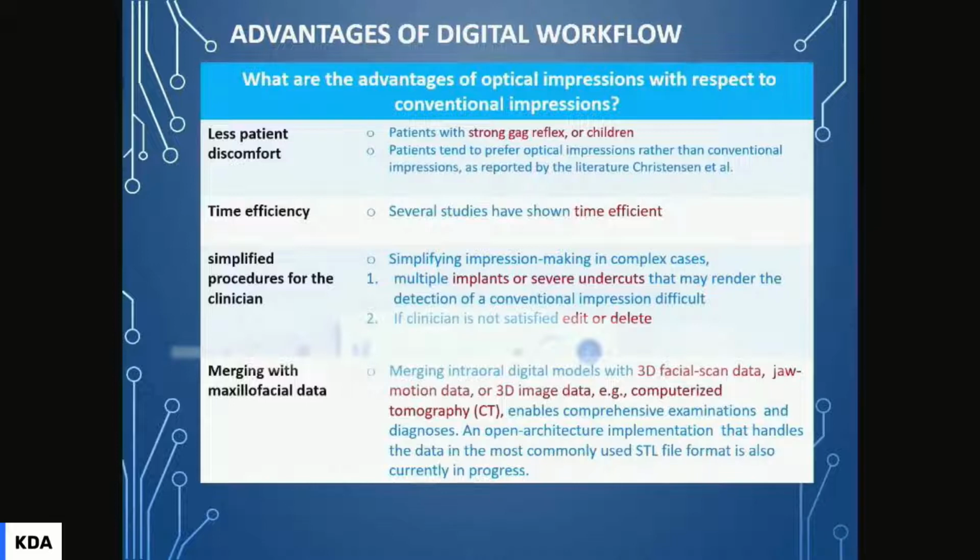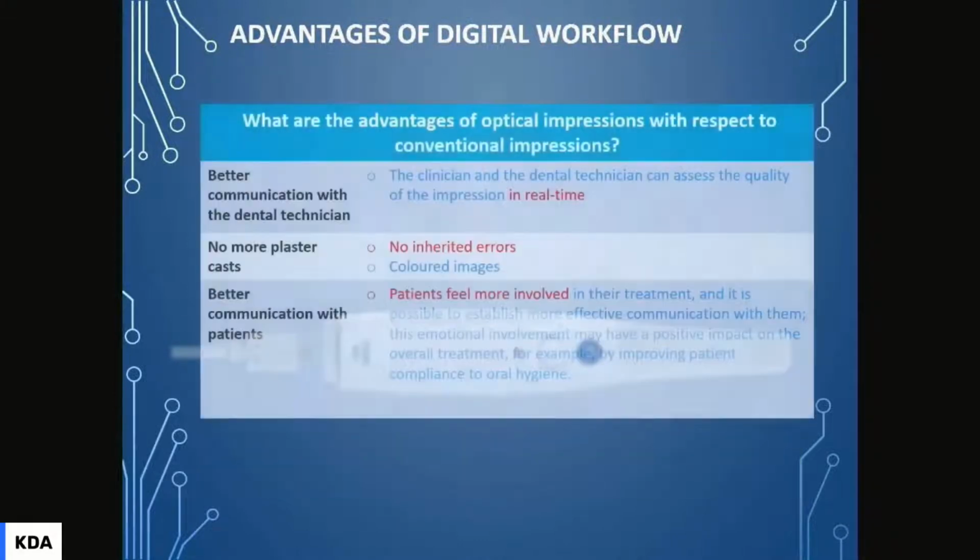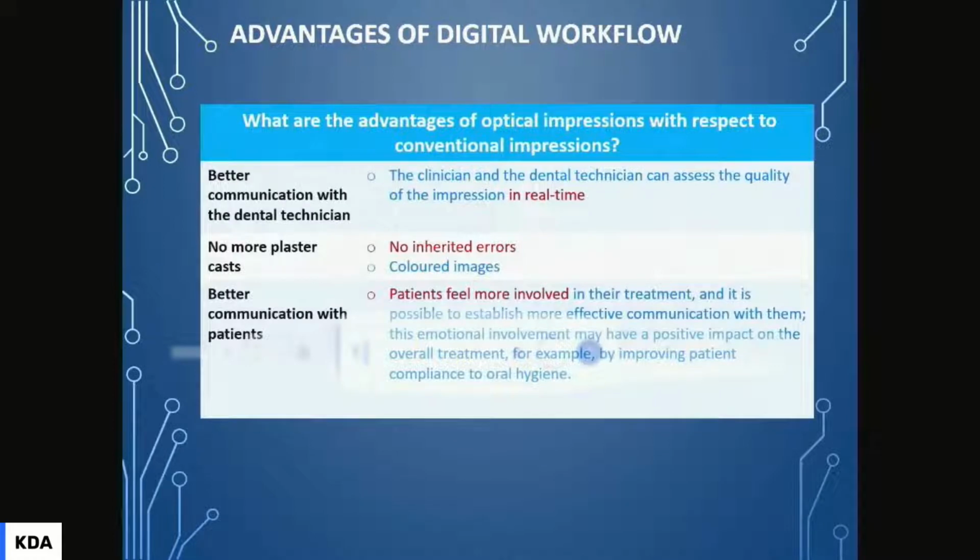Also, we can use them with maxillofacial surgery. I'm sure I remember Dr. Kamal presented a nice case about using 3D with maxillofacial surgery. It works amazingly. Not only that, it increases our ability to communicate with our labs.